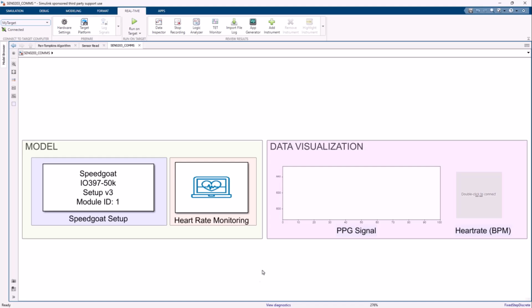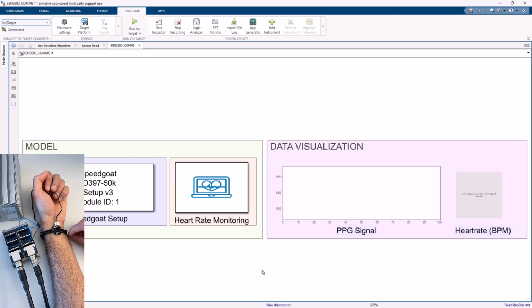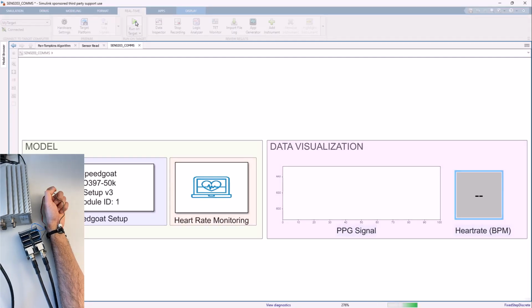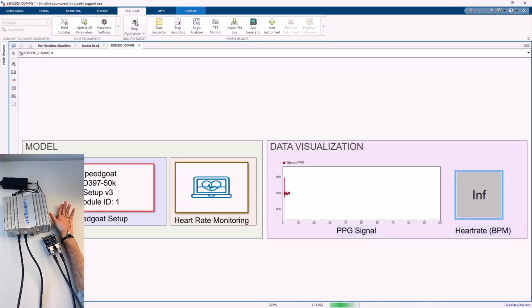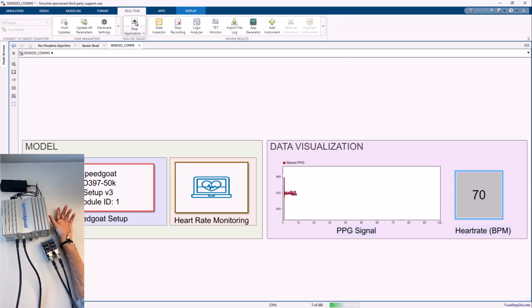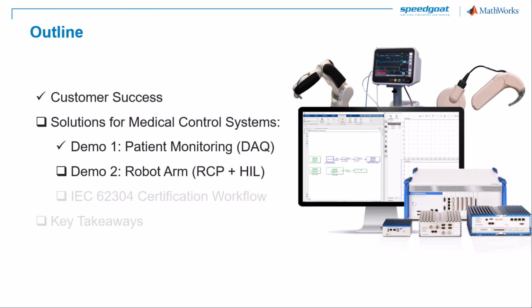So now the sensor is on my hand at this very moment, as you can see on the inset video. I will just click run on target and voila, my heartbeat is visualized in the display block, a resting heart rate of 70 beats per minute, which is a calm way to conclude this data acquisition demo.